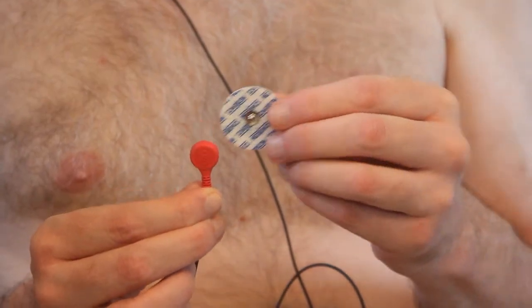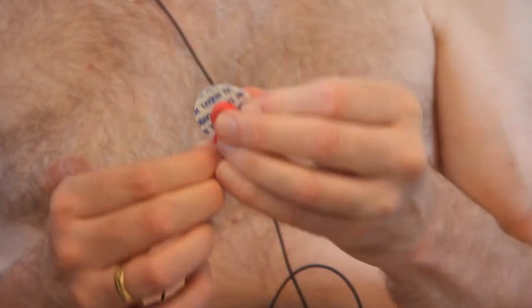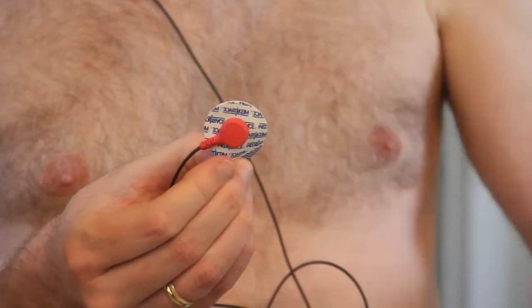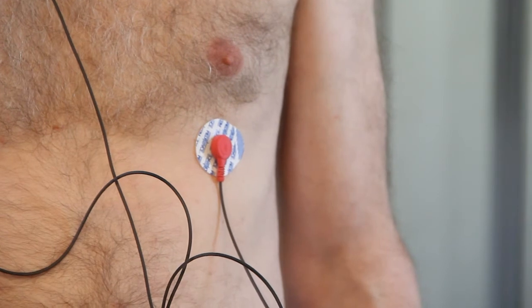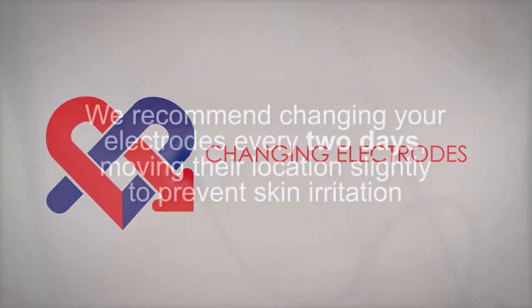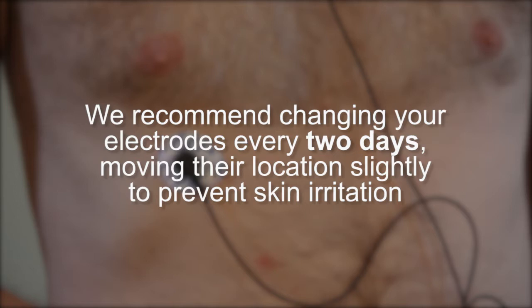Finally, take the wire from the red terminal and snap it onto one of the electrode patches. Peel it from the plastic backing and apply it to the lower left, opposite the black one, in the same position as the black but on the opposite side. We recommend that you change your electrodes every two days, moving their location slightly to prevent skin irritation.